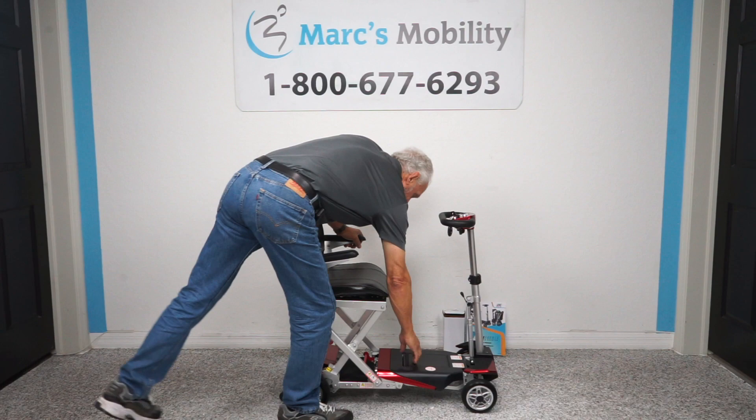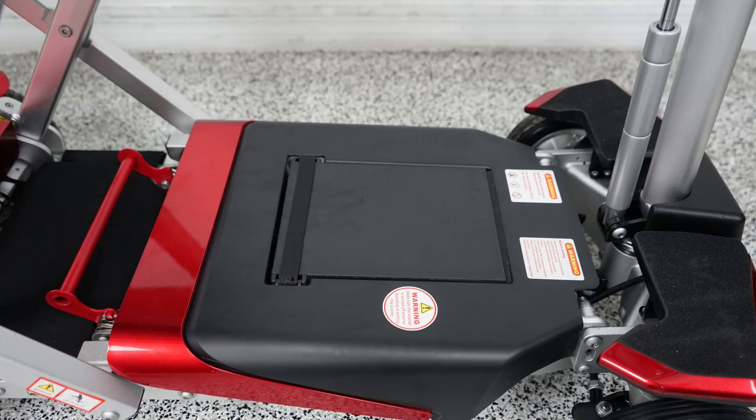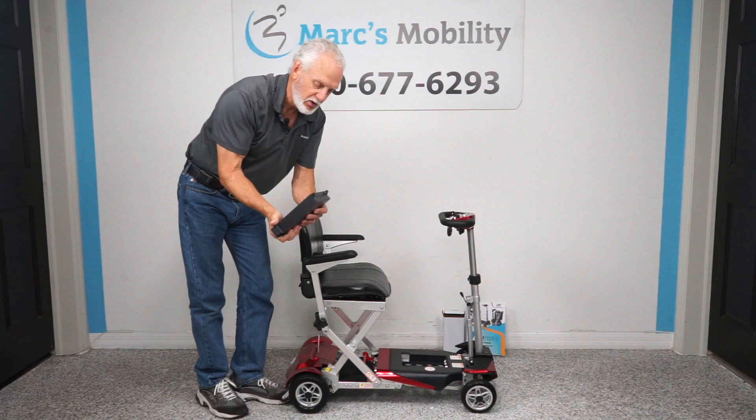Your battery is right here — it comes right out. This is your lithium battery; it weighs about three pounds. You can also get an adapter from Enhanced Mobility or from us if you want to charge this battery in your house. There's a docking device you can put the battery into and charge it in your house, but you would have to order the docking device separately.